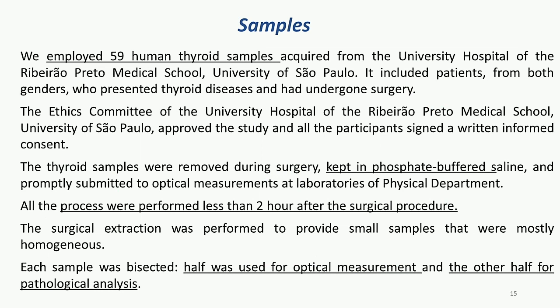We used two sets of samples. The first set was for a grinding experiment, and the second set of samples we used for fluorescence lifetime spectroscopy. The sample was removed during the surgery and kept in phosphate buffered saline solution, and from the surgery up to transportation to our department and making the measurement, we spent 2 hours.